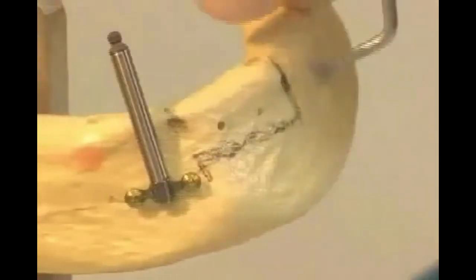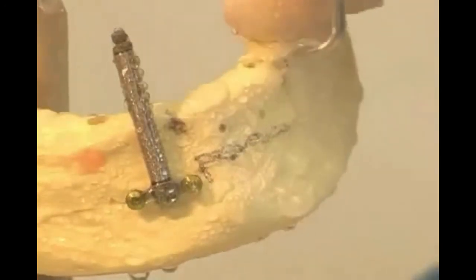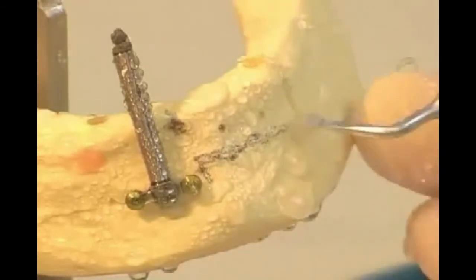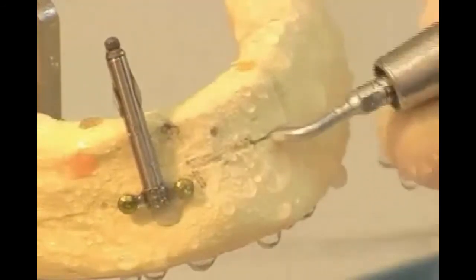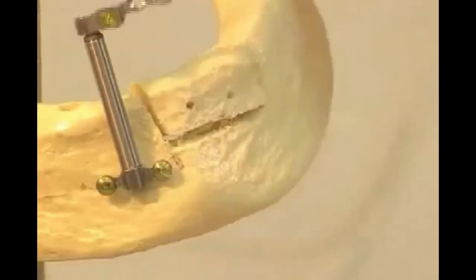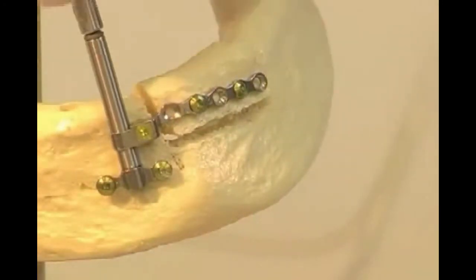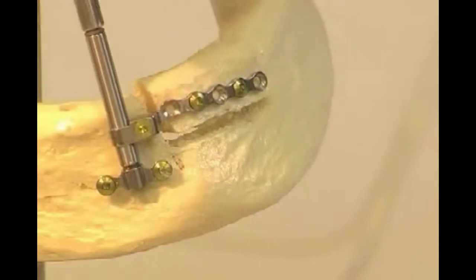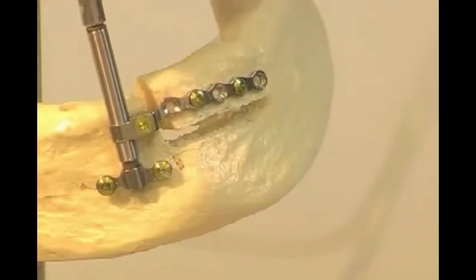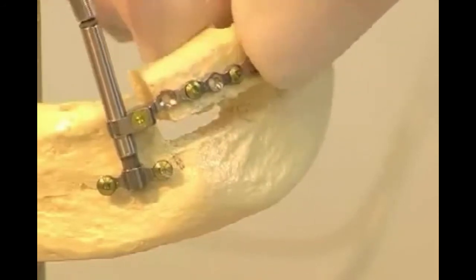Otherwise, it would obviously not be possible to saw away the bone block from the jaw, as we see in this film. Following the mobilization of bone fragments, the distractor is assembled. By turning the winch, which later on stands in the patient's mouth, the bone block can be moved effortlessly and painlessly. As soon as the bone defect has been corrected and the bone is healed, the distractor is removed. There is now enough regenerated bone to perform a procedure such as an implant.